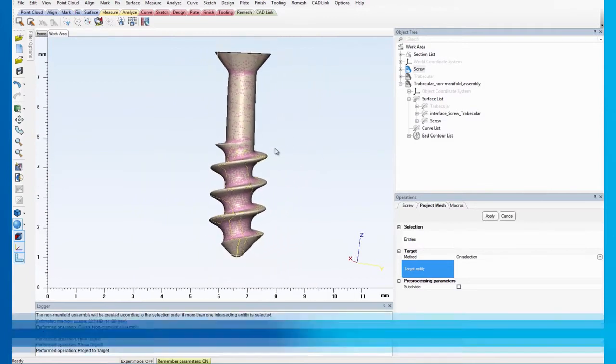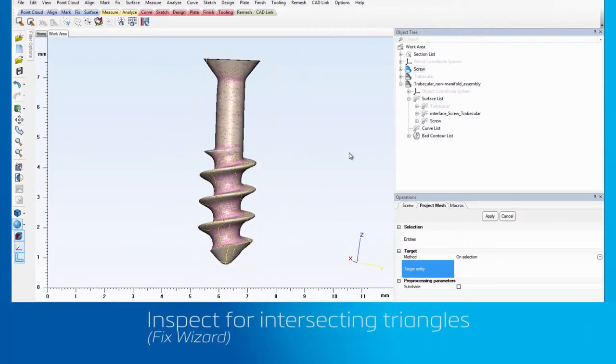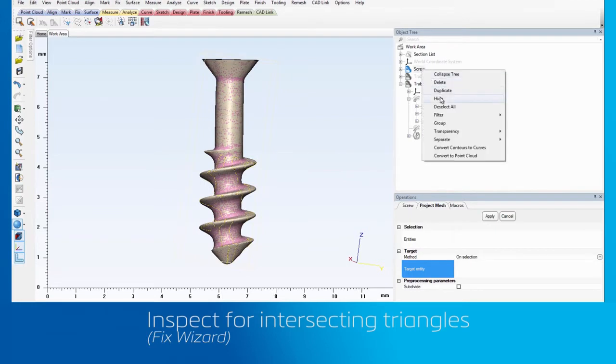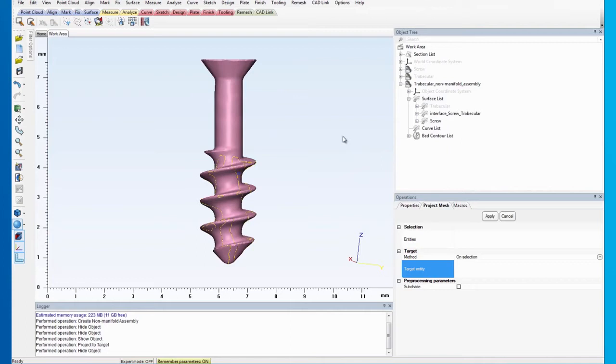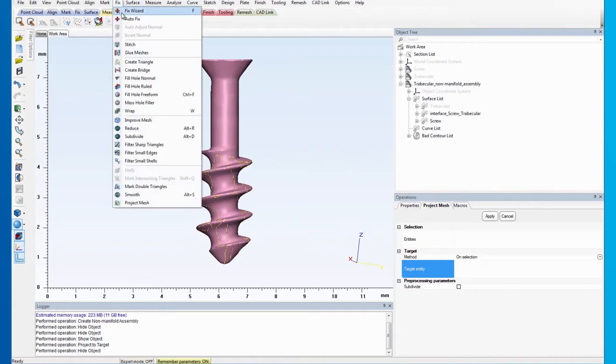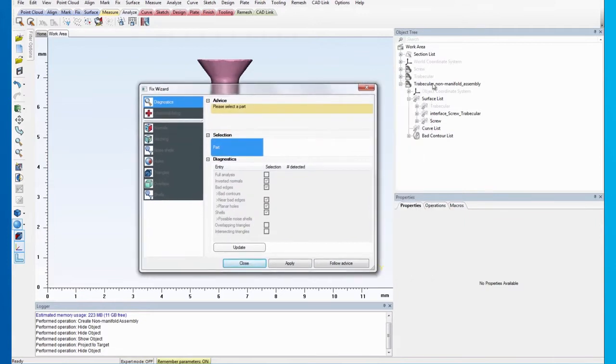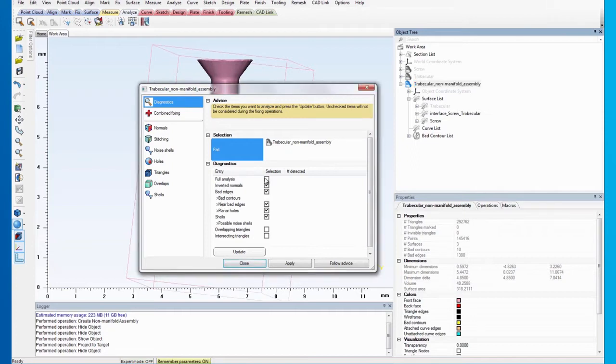In some cases, the mesh projecting step might introduce some intersecting triangles. This is less likely to occur if a smaller grid resolution is used when creating the non-manifold assembly. So, let's use the Fix Wizard to check if there are any intersecting triangles. We can uncheck all the other analyses, leaving only the intersecting triangles checked.